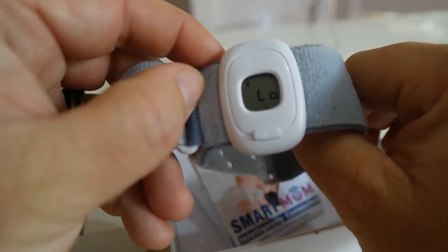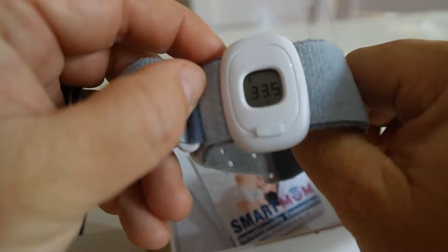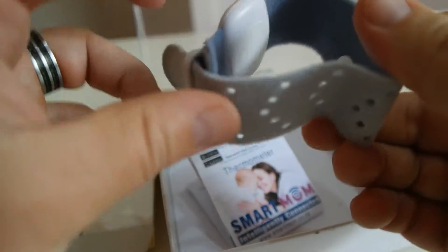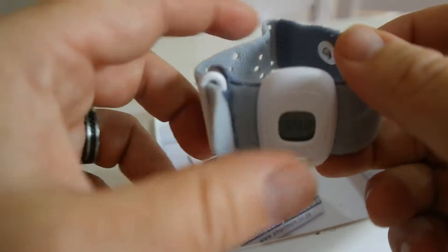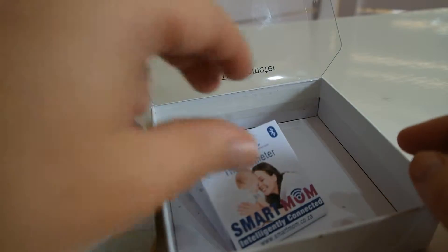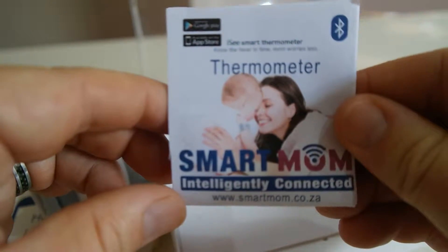So there's the thermometer — see, if I put my finger on it, it starts going and the temperature will climb. You can see it going up. It's 0.1 degree accurate, so it's really accurate.